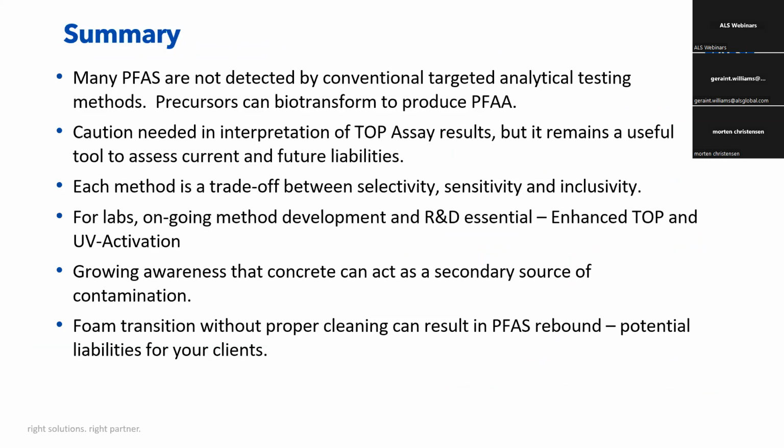So just in summary, there are many advantages to the TOP assay technique. And I would say that TOP assay can be used with other techniques. It's not a mutually exclusive technique. It can be used with total organic fluorine, combustion ion chromatography. It can be used with high-res MS. Every analytical technique has its pros and cons. There's always going to be a trade-off between sensitivity, selectivity, and inclusivity.